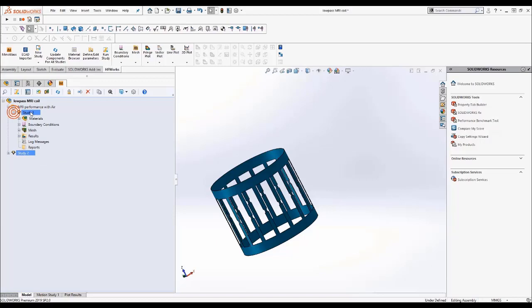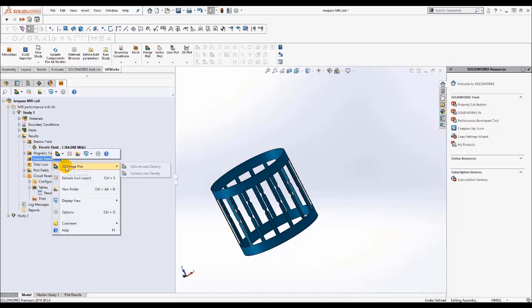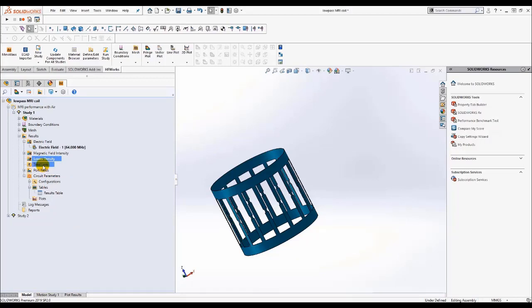As we said, we have here an already created and solved study. This section of results will be added automatically after the run is done. We have some results here. We have the electric field distribution, the magnetic field intensity, and losses: volume losses, the dielectric losses and also the conductor losses. Two types here, volume losses for dielectric and surface loss for conductor losses. We have a calculator here to compute your total loss.